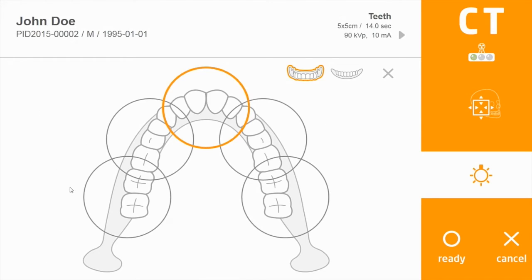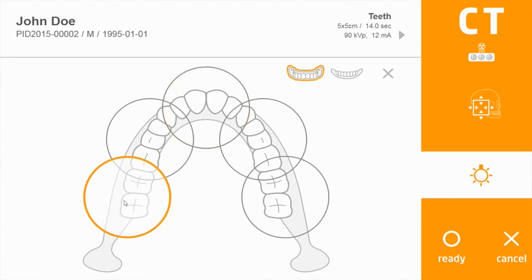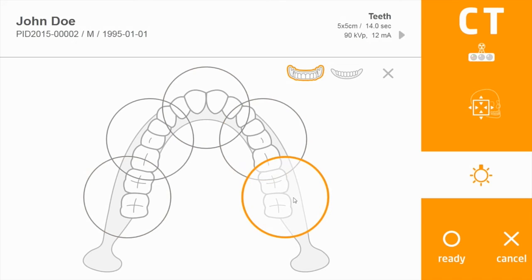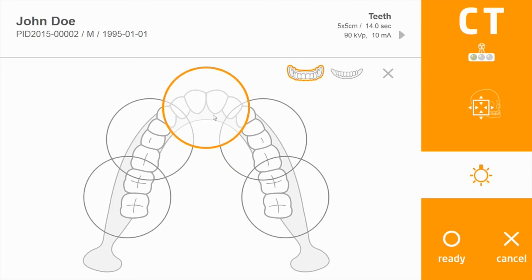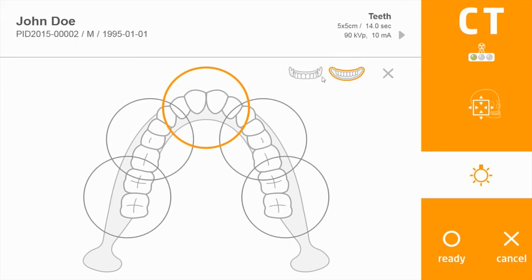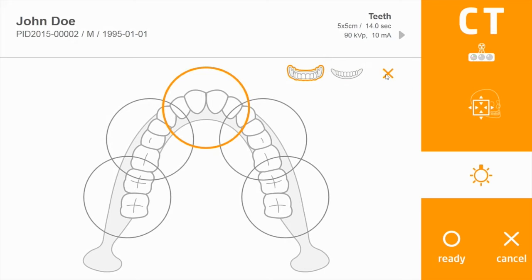Below the standard option is teeth mode with 200 micrometers. By clicking the icon, you'll have a slightly different interface that lets you select the areas you're interested in. You can also choose either mandible or maxillary scan with a single click.